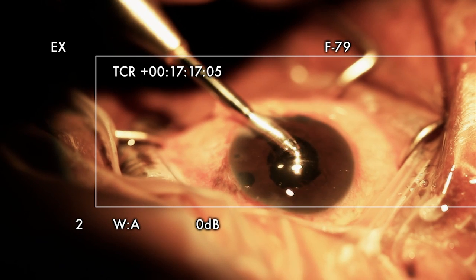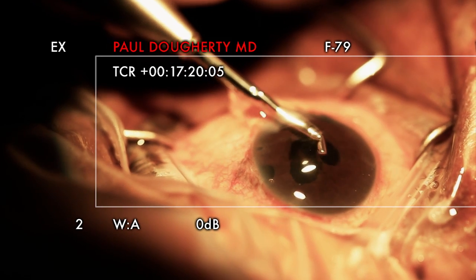We used to do these iris suture things — the three-point thing — and they never left the same after that. But her pupil may still be a little bit... oh look at it, it's looking better already.